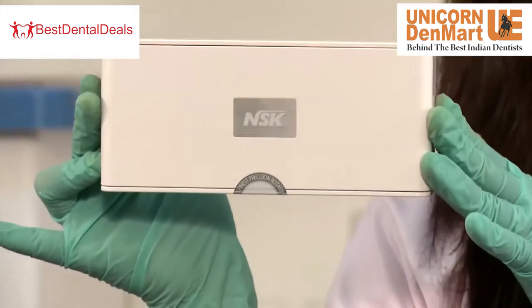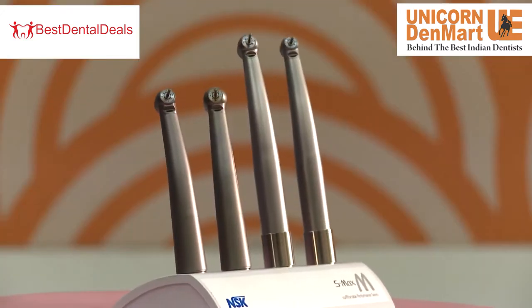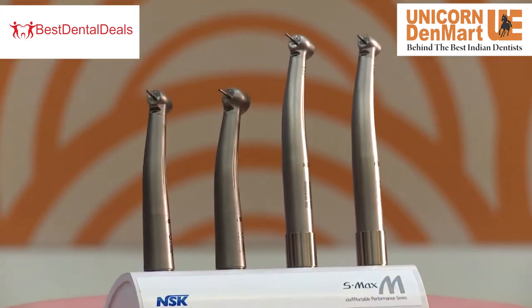The satisfaction of knowing you own the best. NSK Japan has designed and manufactured high speed performance handpieces which are in total harmony with the human touch.